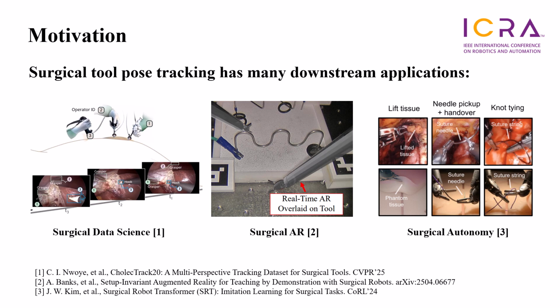The motivation of this work is simple. Surgical pose estimation and tracking are important. It is the foundation of many downstream applications in robotic surgery. For example, in surgical data science, the motion of instruments is the determinative data for surgical phase estimation, skill assessment, and action segmentation, etc.